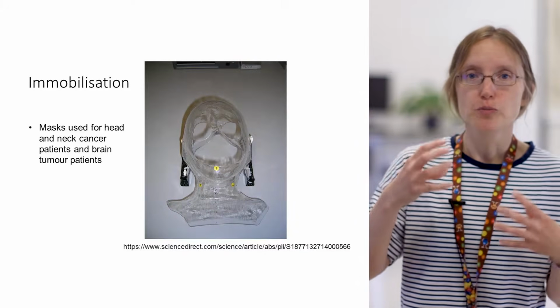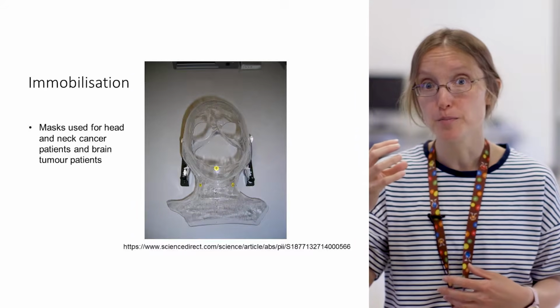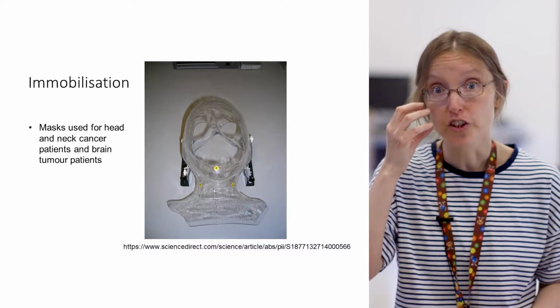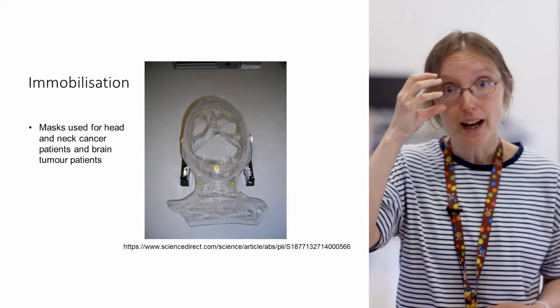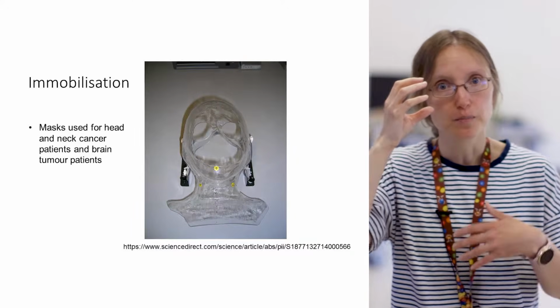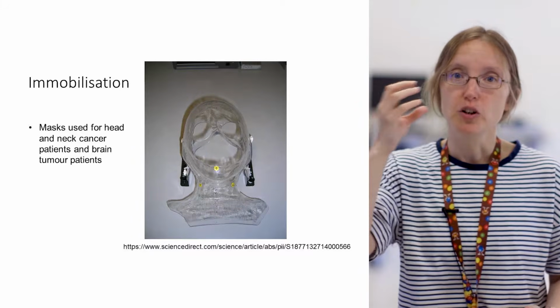If somebody has a tumour, let's say on their cheek, I want to make sure that every time I turn the radiotherapy on, maybe for 35 treatments, I want to be confident I'm definitely going to treat the cheek. If I go too high, I will miss the tumour and I'll put some radiotherapy through the eye. That could make the person blind, that could give them a cataract. Equally, every time I turn it on, I want to hit the cheek.